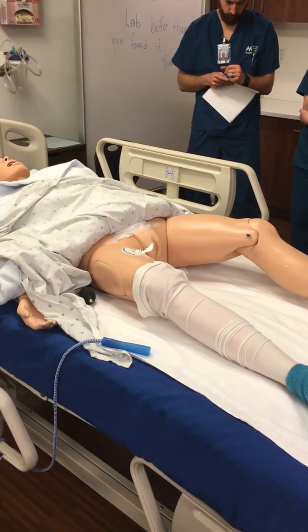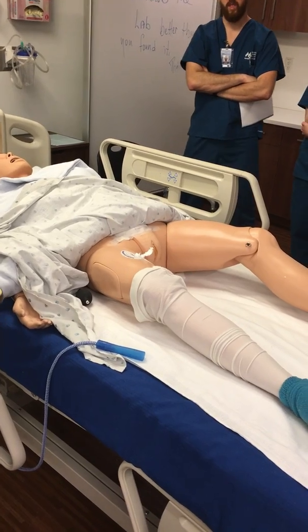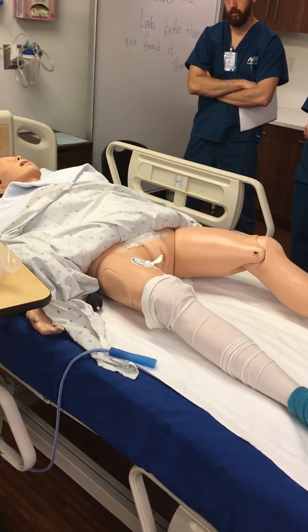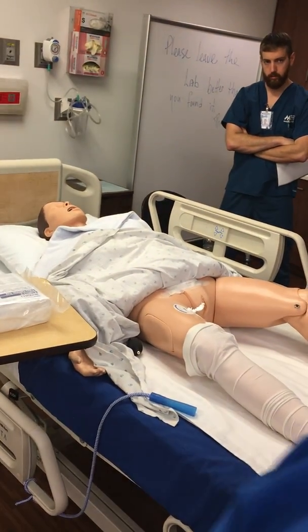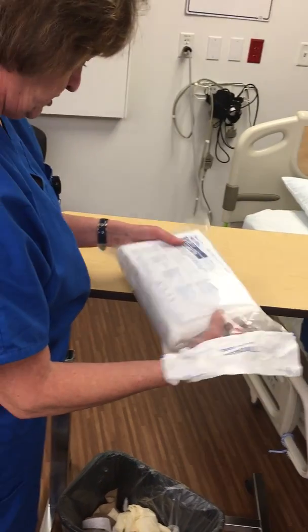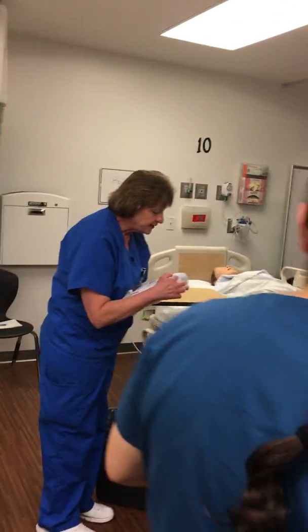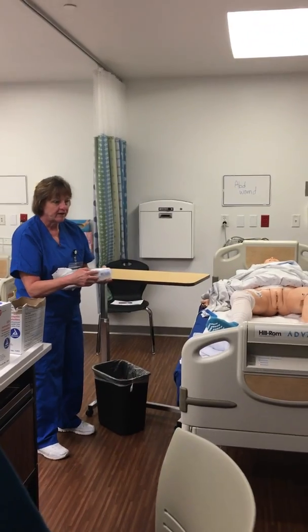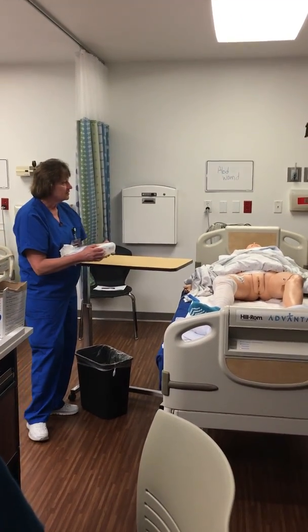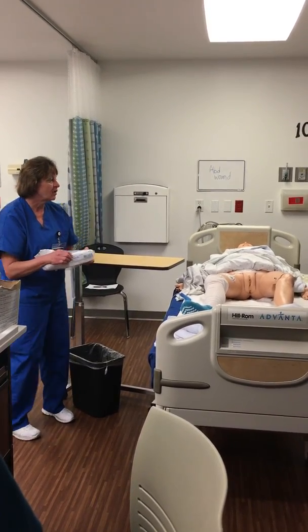Now I make sure I've got everything I need — my waste basket, my catheter kit. I'm going to place this at a good working height for me and open my kit. Before I do so, I want to show you that on your kits, the numbers of the catheter are here. This one says 14 French 5cc, which means that's a 14 French lumen — the size of the catheter — and it's got a balloon that holds 5 to 10 milliliters. Now with the catheters, the higher the number, the bigger the catheter. It's opposite of the needles.